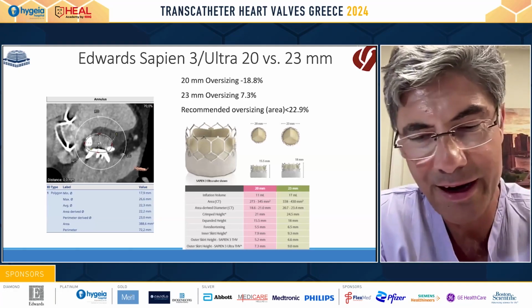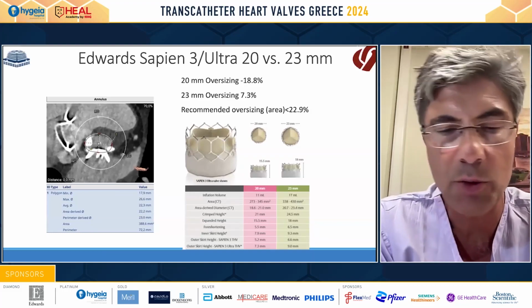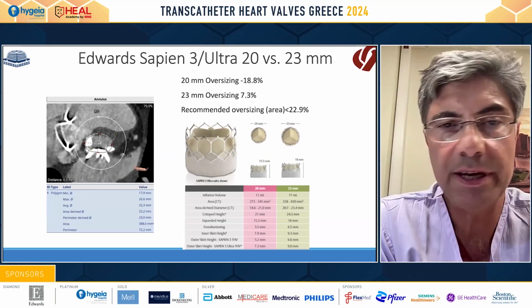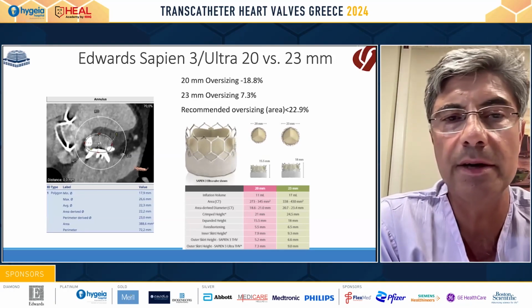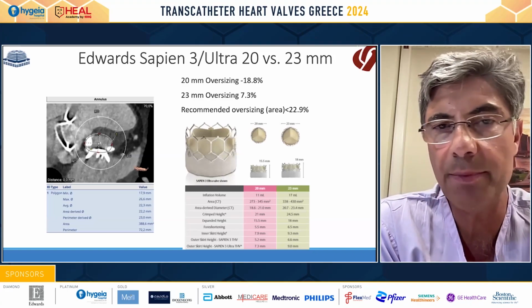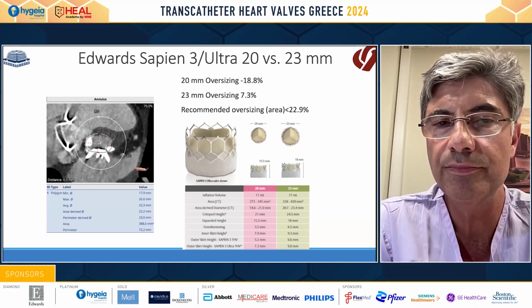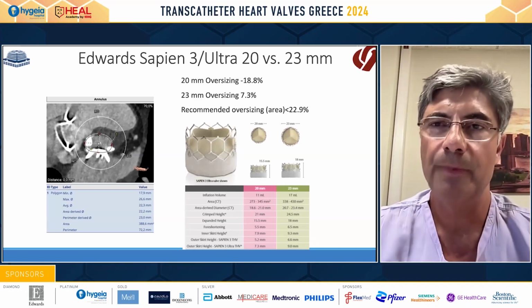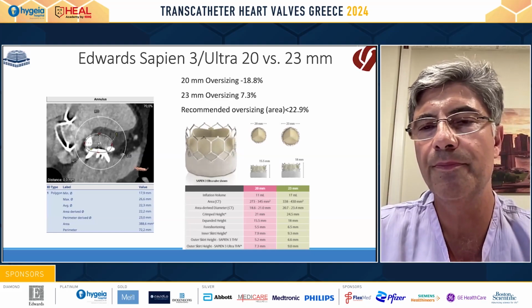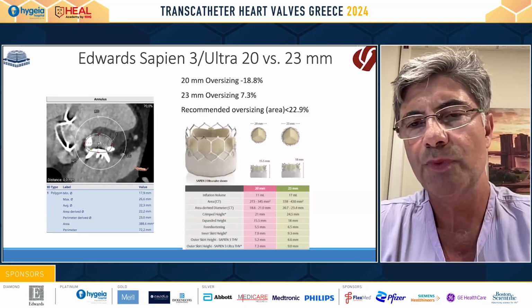Well, Theo, nice hearing from you. No, we don't do that. We just rely on our measurements on CT before, and as you can see in the case that we are presenting, we are doing our measurements by TOE real time in the cath lab. Sometimes CT in different angles and different perspectives can give some errors, and the fluoroscopy between different angles during the implantation also gives very good information.